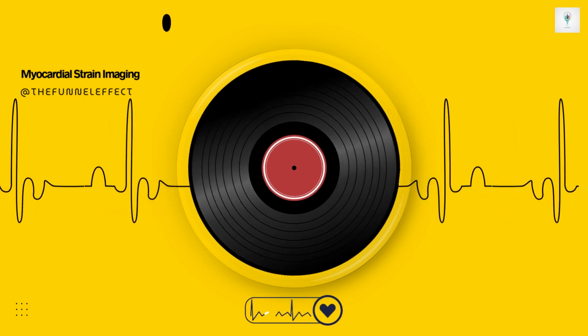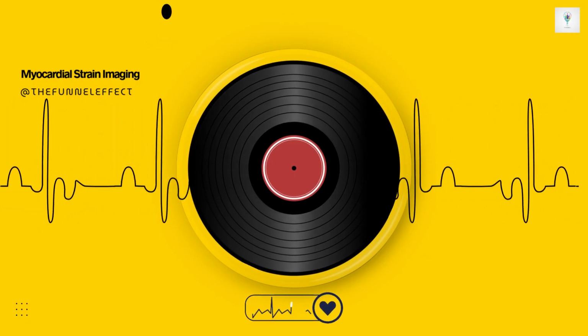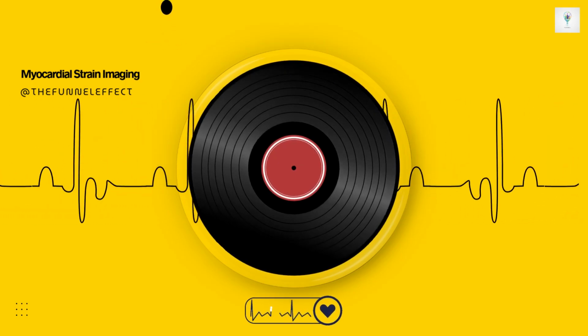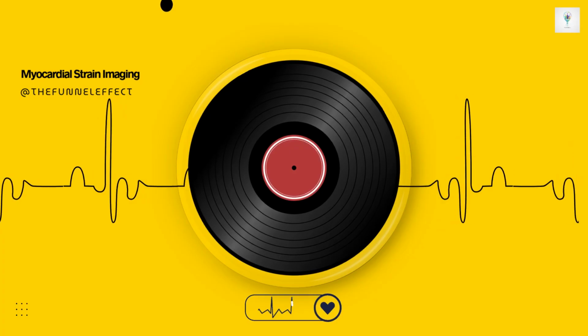You see, first, a simple reduction in the amount of systolic shortening, we call that hypokinesia. Less contraction. Right. In more severe or acute cases, the affected segment might not contract at all, or might even bulge outwards during systole, that's dyskinesia. But a third, often more subtle but very characteristic feature is post-systolic shortening, PSS.